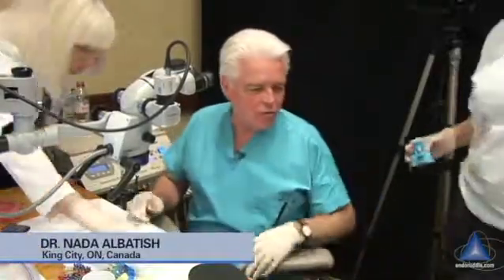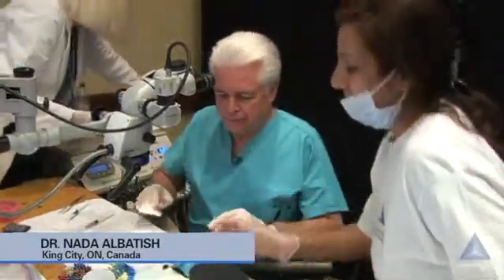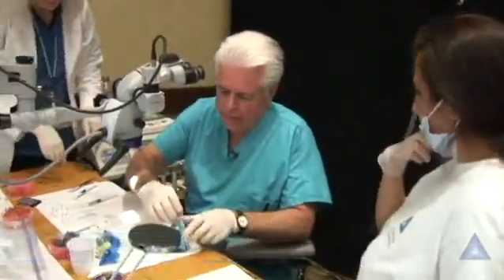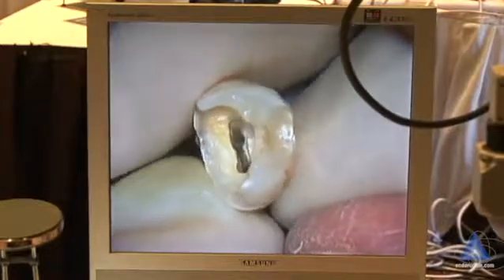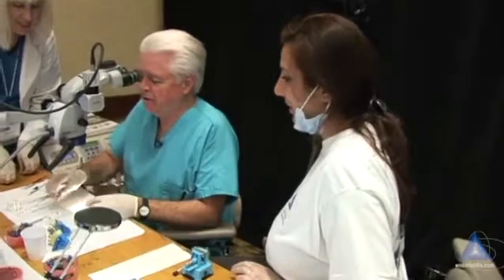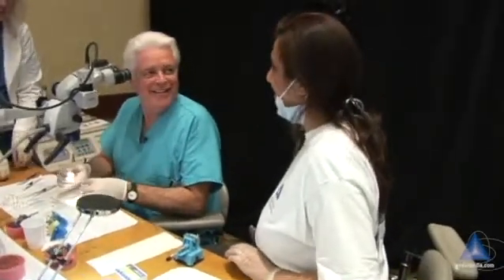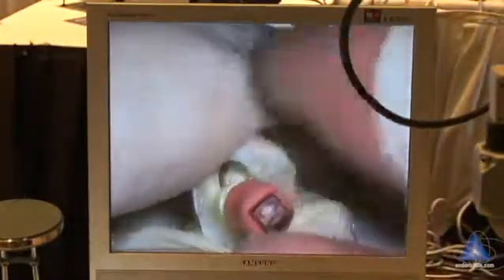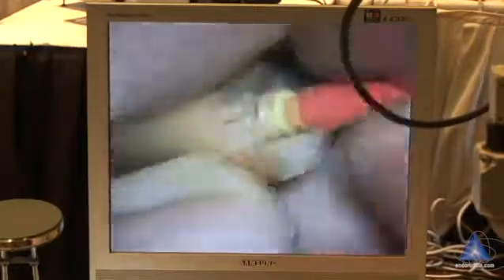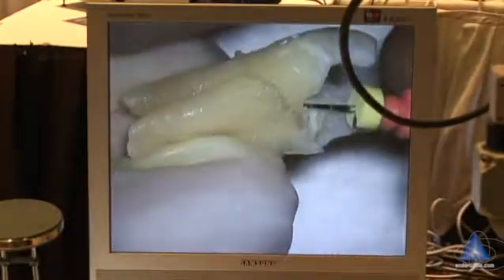Okay, have a seat. So this is a three-rooted premolar. I had just found two canals and while I was waiting for you I was digging around trying to find the third one — and I think you just found it. Cool, so you didn't even need help. There's that one, that's the one you're talking about. And then there's that one — yeah, that one I'd already gone down. You did that beautifully, and here's this one you just found.